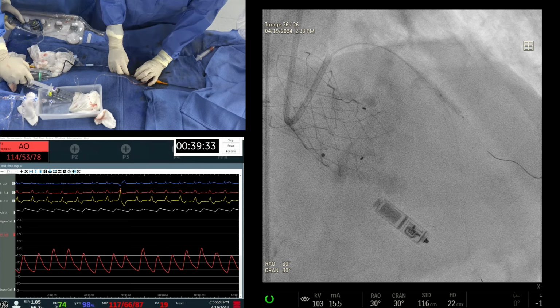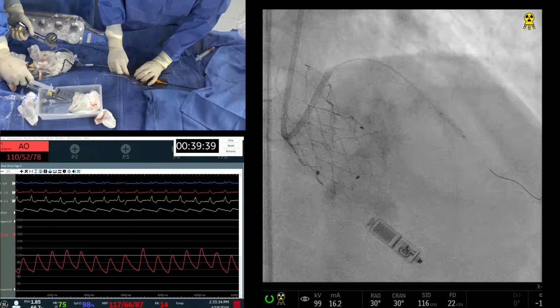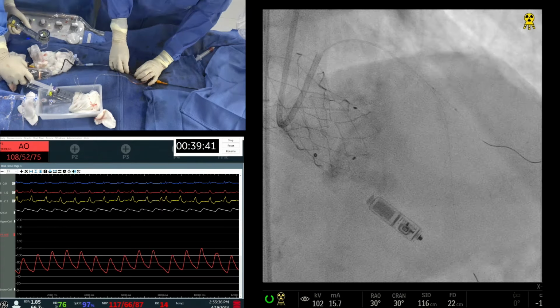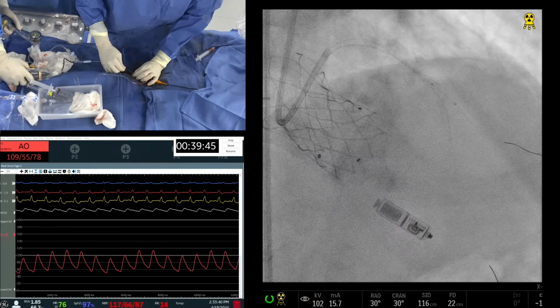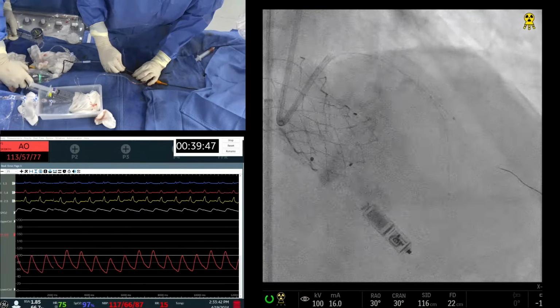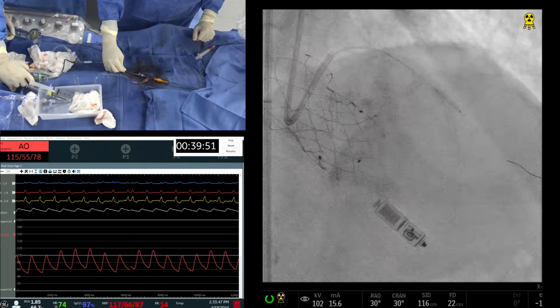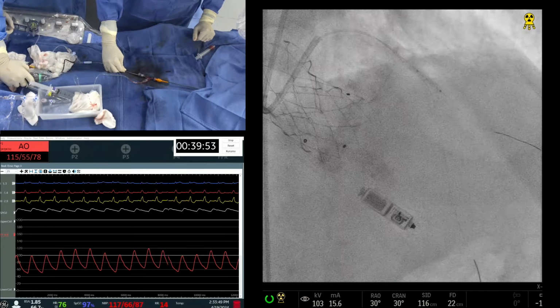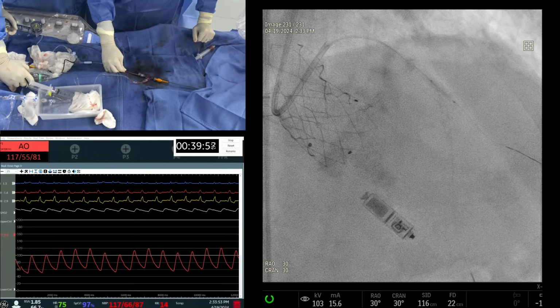And the question comes: do you need to do IVL in that calcific nodule? To me, I think it looks good. I think you shaved it off. Yes, Anu did a great job with the technique, and you shaved off a significant amount of the nodule. So if I have something left, I know it's only 2.5. I touch that a little bit, the sonic wave will do something. I touch it on the way back. I wouldn't do another one in the proximal area. What do you guys think?